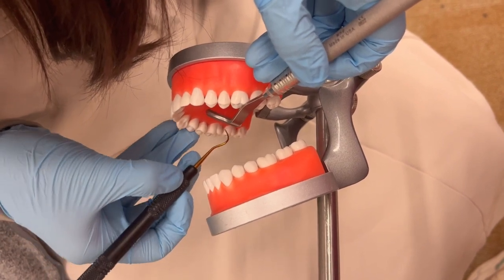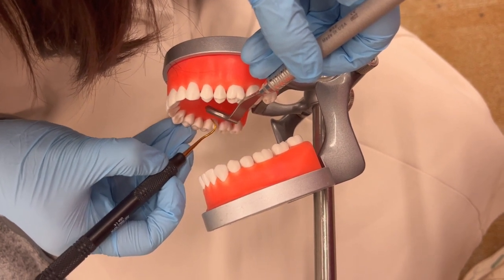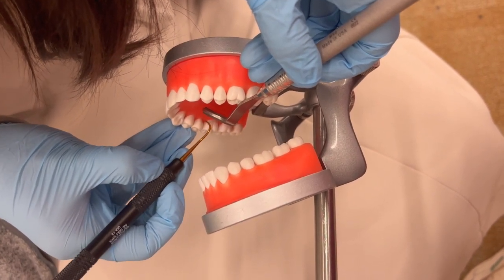So remember to use the visual cue to select the correct working end of the posterior sickle scaler, and to tilt your lower shank slightly towards the tooth to establish the correct face to tooth surface angulation.